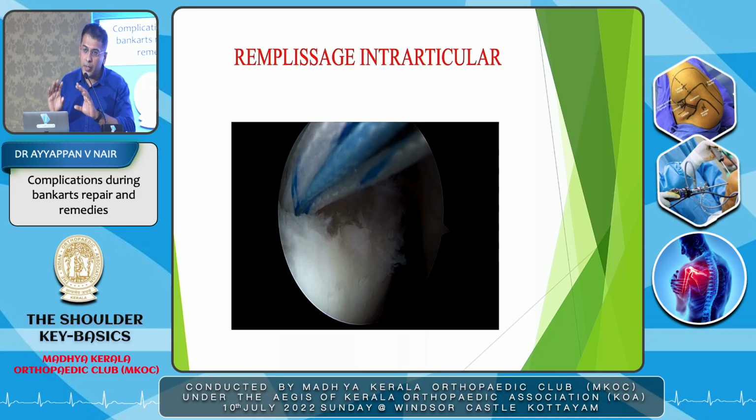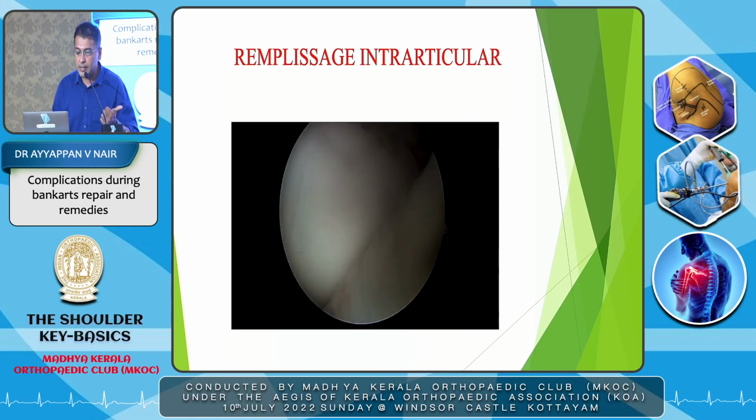The key to prevent the breakage is we can do a trial. That means we know where to take a bite. You're pushing it in. Without taking a bite, do a trial. See where it is exiting, where it is coming out. Then you go in and do it. That would tell you the trajectory where it is coming out, then you can catch it faster. And then, as I said, the axillary nerve, so you have to be careful when you're doing the releases down. And anchors also, there are documented instances when anchors or drills past a 6 o'clock position can cause problems, but overall it's quite safe.